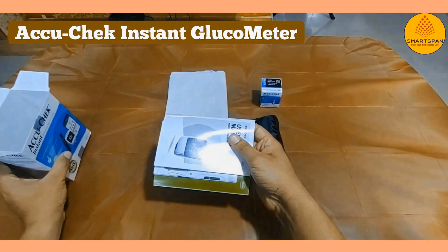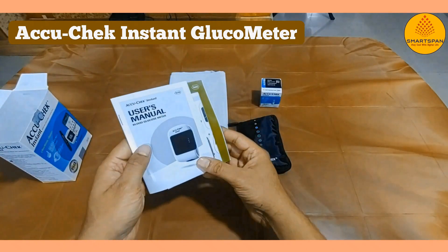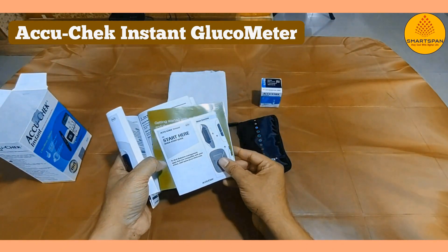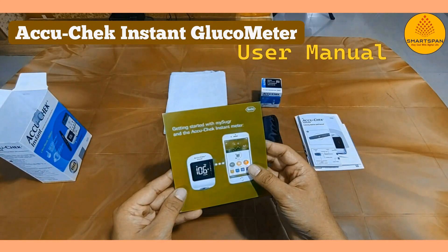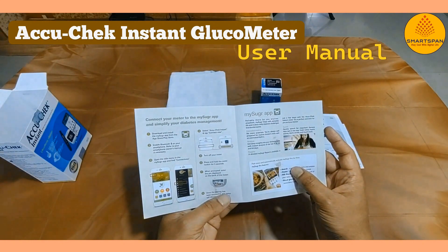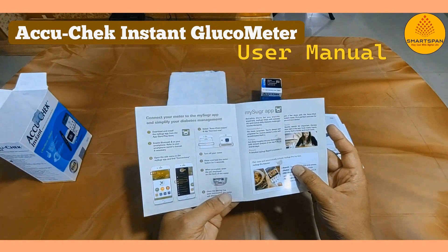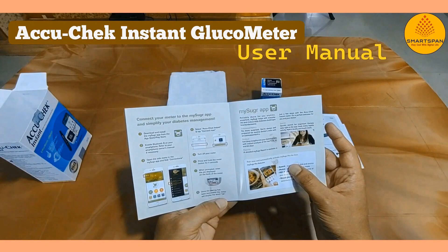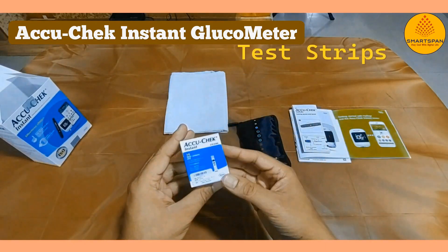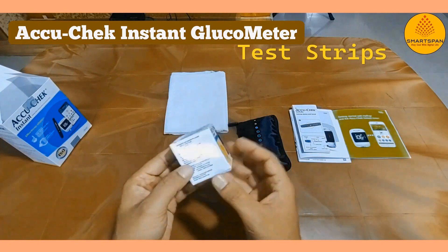Let's take a closer look at what's inside the box. Upon opening, you'll find everything neatly arranged. Here's a quick rundown of what's included. AccuCheck has provided us with a user manual and a quick start guide — these resources are incredibly handy for setting up and using your glucometer.